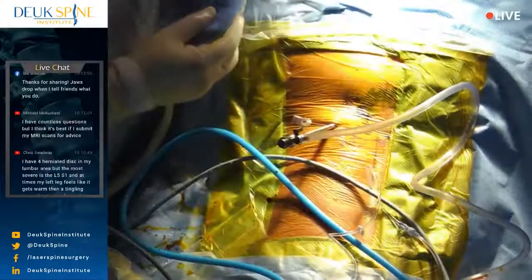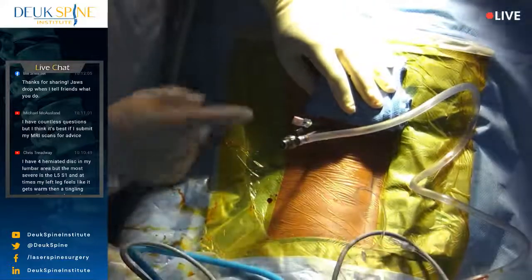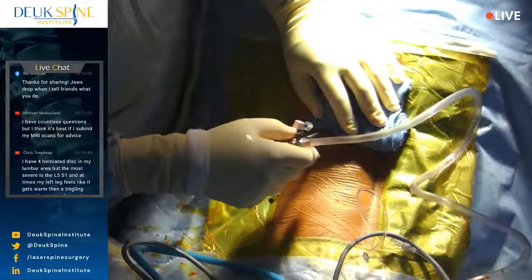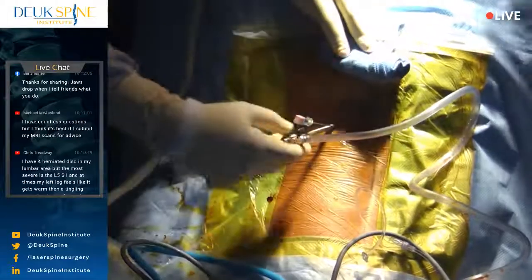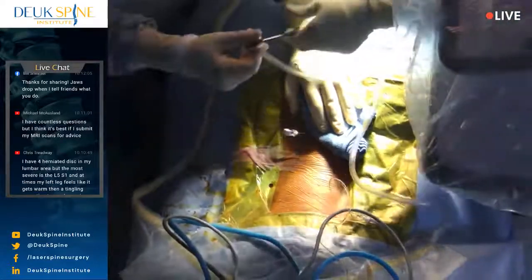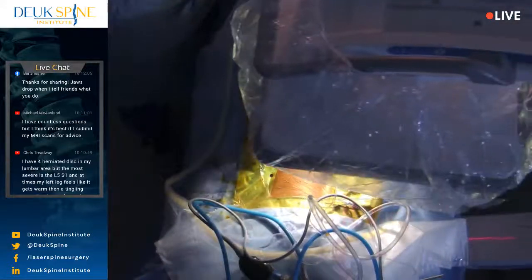Now, we already have the other needle in place. Come on in. Okay. Can you guys see this, Diego? Yes. I'm going to pull this tube out. Okay. Just apply a little pressure to the muscles so we don't get any bleeding. Come on in.